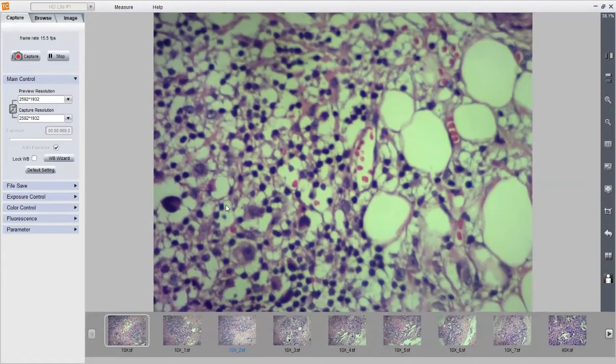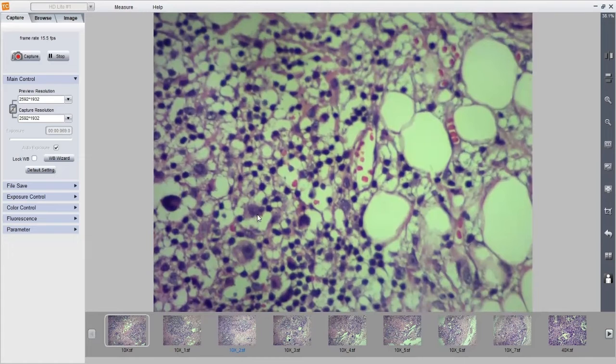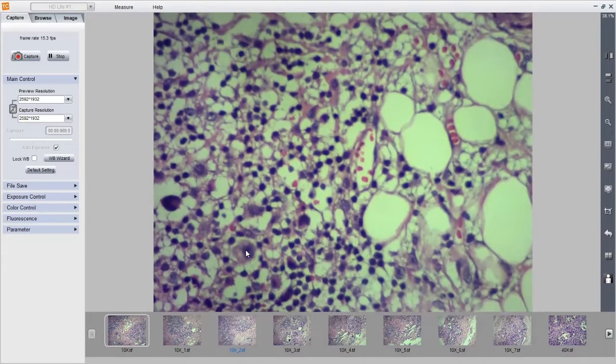a T cell lymphoma. In a T cell lymphoma, there is no clear-cut separation between the Hodgkin cells and the reactive background. There'll be different sizes of cells: large, small, intermediate, mixed. Whereas in Hodgkin lymphoma, characteristically, you get these large cells standing out in the small reactive background, which will be visible even in a low power view.